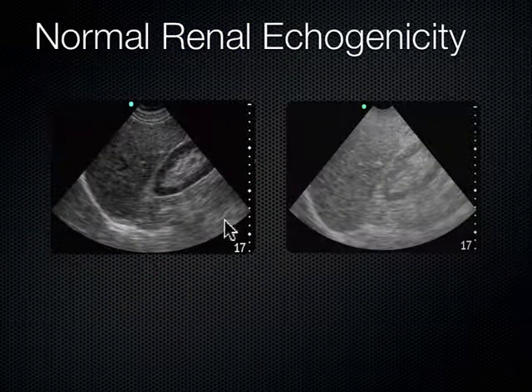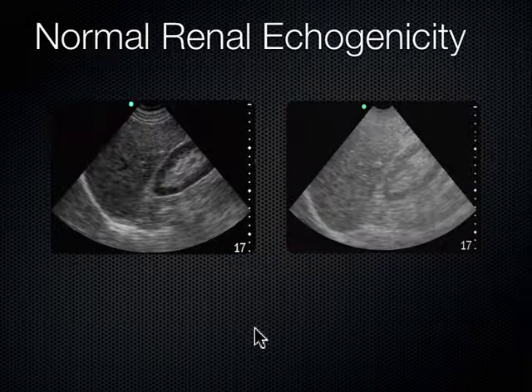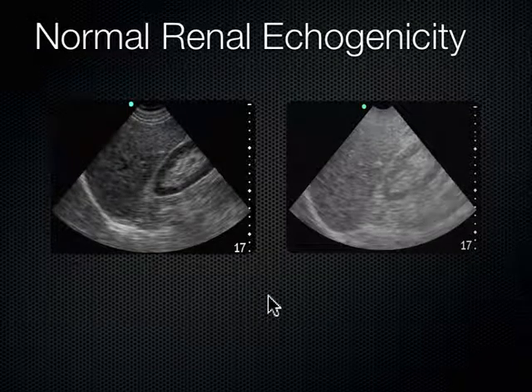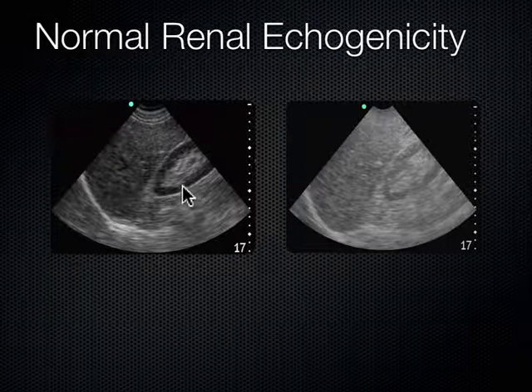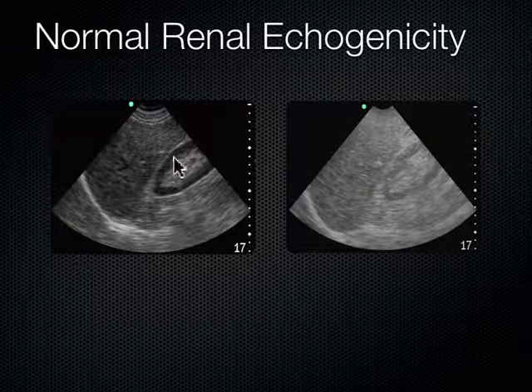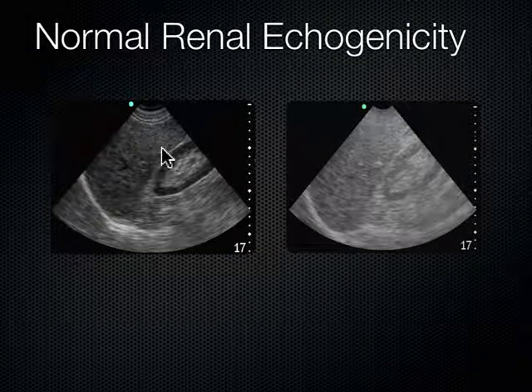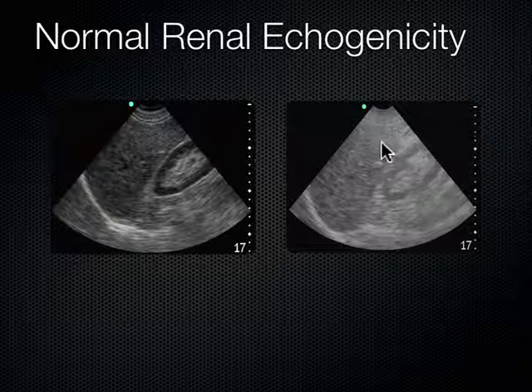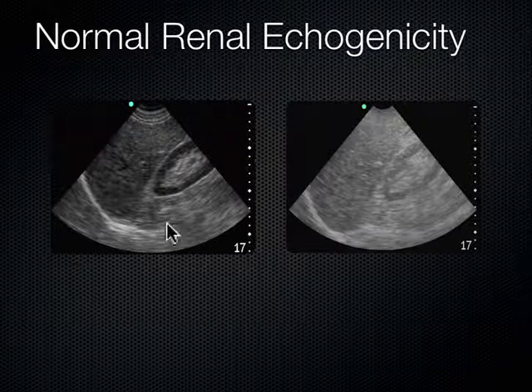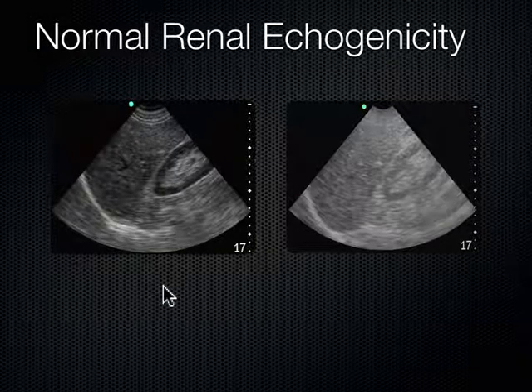Looking at these two images — they have the same depth, ranging down to 17 centimeters — but the right image is over-gained, pretty washed out. The left image shows the cortex of the kidney as slightly darker than the liver, which is correct. If you can make out that subtlety, your gain is adjusted just right. Over here when over-gained, it's hard to tell the cortex is less echogenic than the liver. I know I've got my gain set right when the kidney's cortex looks darker than the liver or spleen.